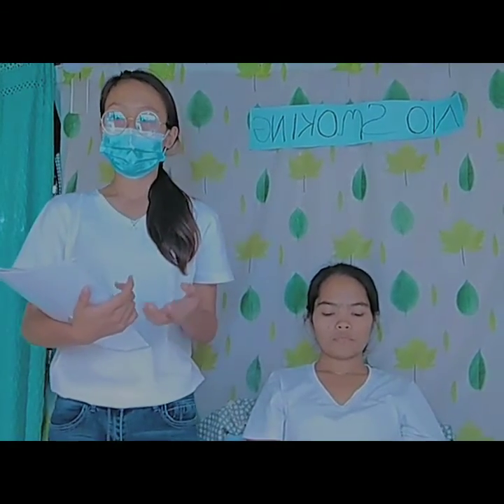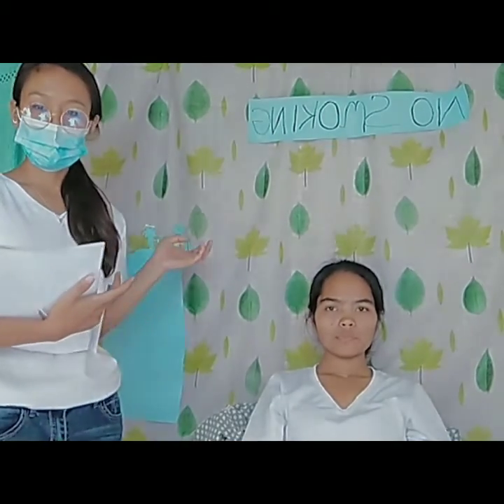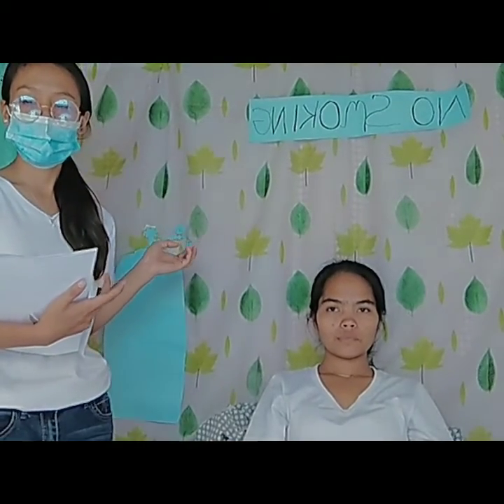So here we have our tank, where the oxygen is stored. We have our humidifier to prevent the nasal cavity from drying out, as it humidifies the flow of the oxygen.